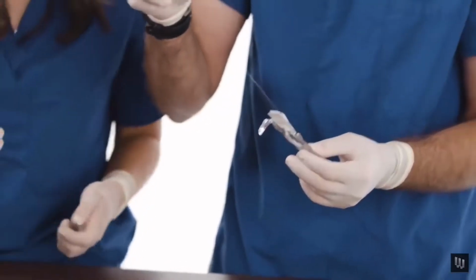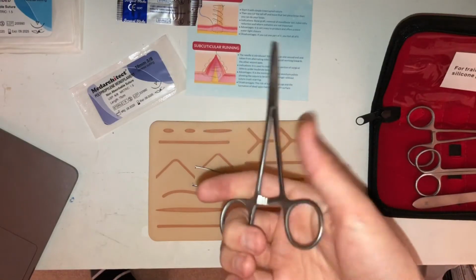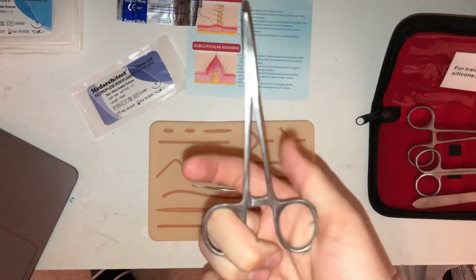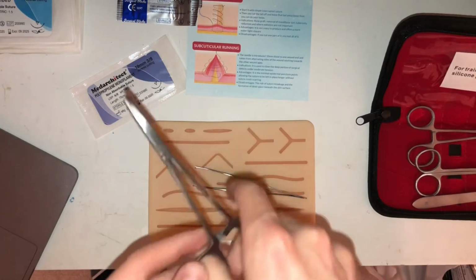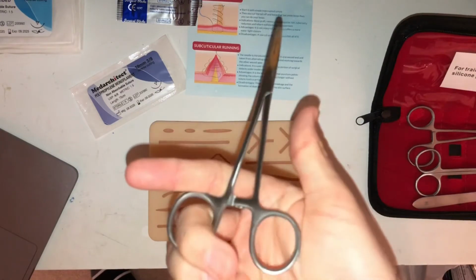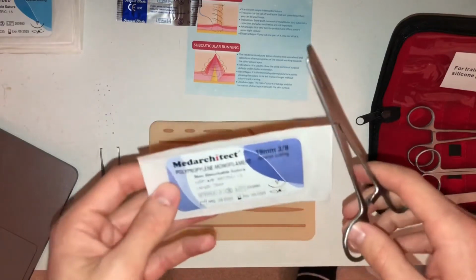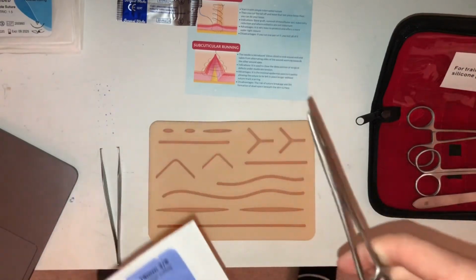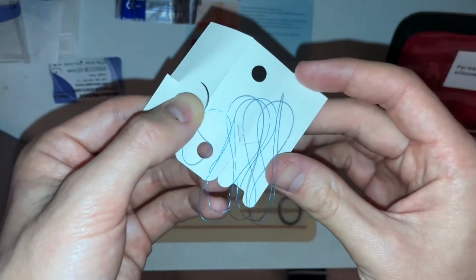Yep. Okay, wait. So here's how she was talking about holding the needle driver with your hand like this and pushing it with the butt of your hand. Because obviously she said you don't do this, which I guess might just be easier. So you have to lock it with the palm of your hand and then relock it with the palm of your hand. And for taking out the suture, she said it's actually okay if you put your thumb in the needle driver. So let's take that out now. There's the little needle we're going to be using. Hold that down with my thumb. And here's all the filament we got to put into the suture.